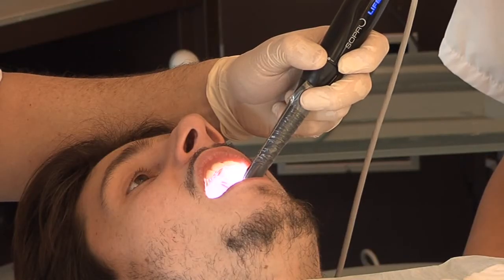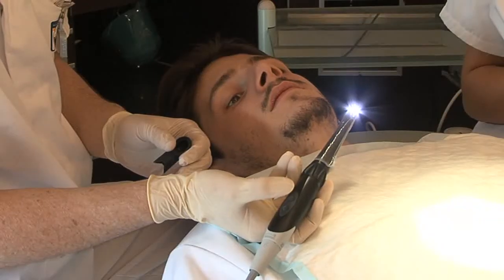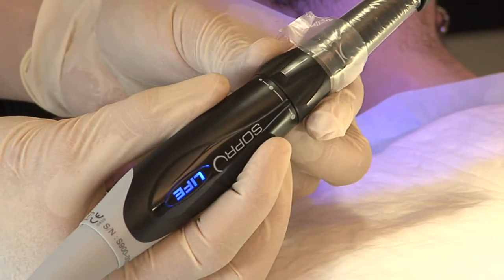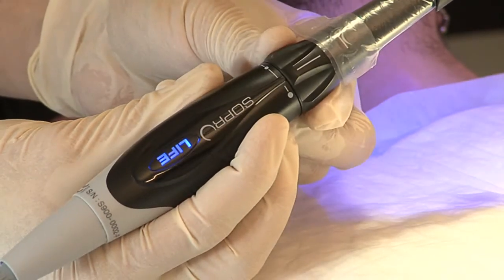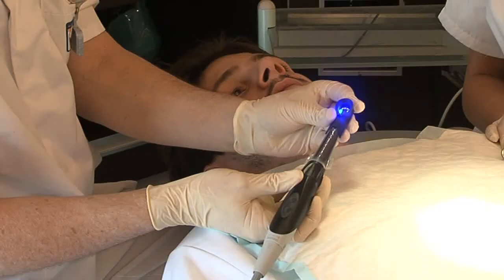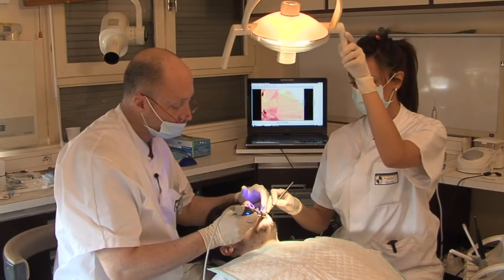The Soprolife protocol for the detection of tooth decay begins with a comprehensive examination of the patient using the diagnosis mode. After adjustment of the setting ring, all you need to do in order to obtain clear and high quality images instantaneously is to place the distal tip on the Soprolife and start making your diagnosis.